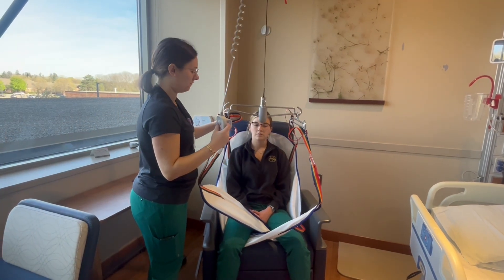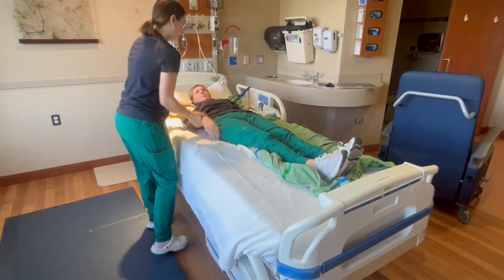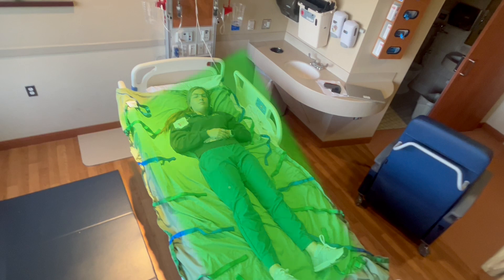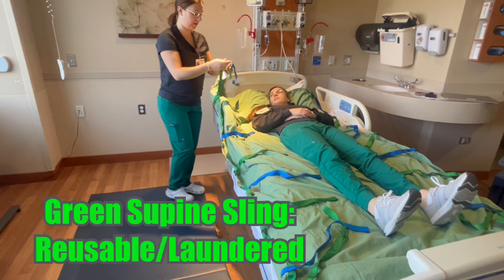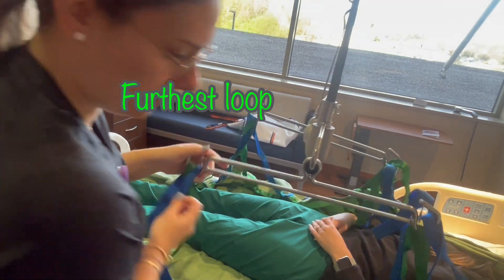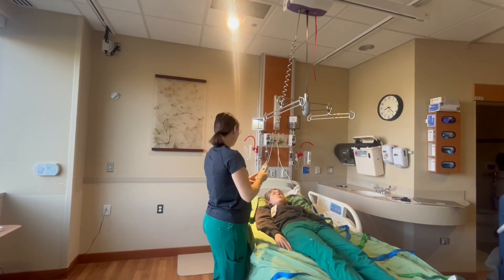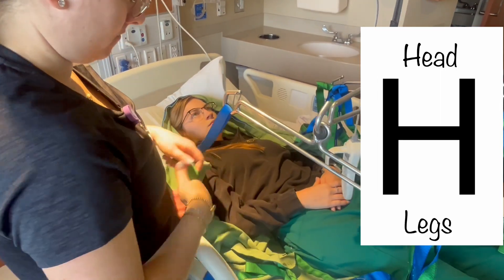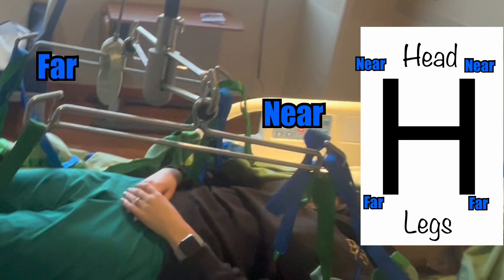The seated sling is ideal for transferring to or from a chair or commode. For the supine sling, the patient must be in a supine position. Using proper rolling and repositioning techniques, get the sling under the patient, positioned in the middle so that both their head and feet are inside the sling. If the patient is very tall, the feet can extend past the sling, but the head must remain inside the perimeter. The green sling is a reusable laundered sling, though disposable products are also available. The supine sling has eight straps on either side with intermittent loops to adjust the distance from the lift. It is always important that matching straps on the right and left are on the same loop to properly balance the patient. Four straps on each side attach to the top hook, and four to the bottom hook. The head straps balance better when attached from a lower loop, bringing the sling closer to the lift, while the foot straps should use a higher loop, providing more distance from the lift.